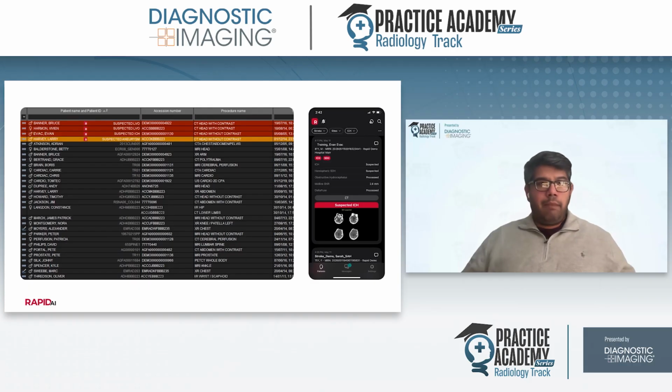So what that practically looks like, let's say you have 40 head CTs on your list, you start with number 1 and the first 20 are negative, but case number 23 has a positive finding. By the time you get to it, it's already been an hour or 2. So having a worklist prioritization tool that bumps that case to the top of the list makes it much easier for us as radiologists, so we know which case to prioritize, which case to get through first.